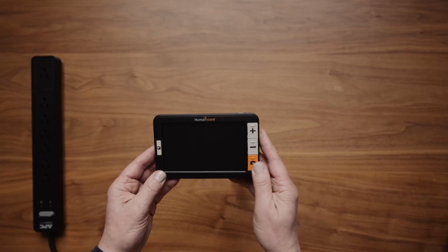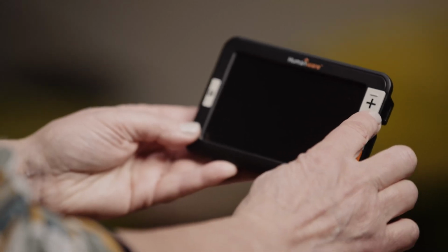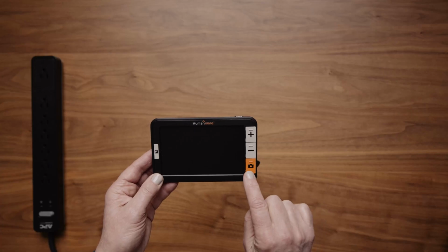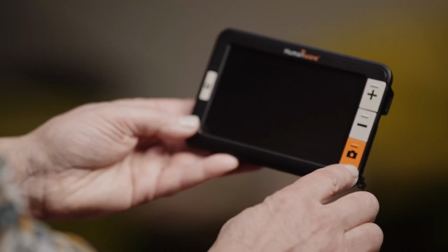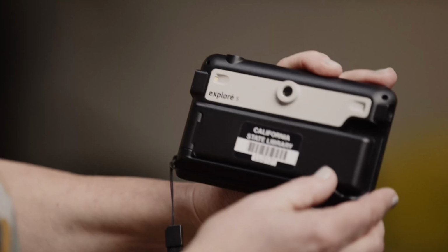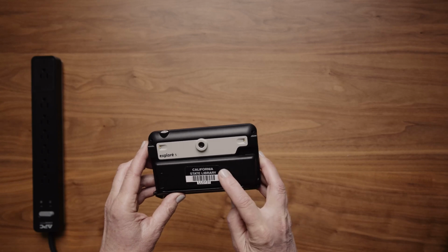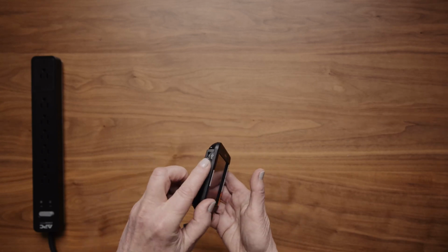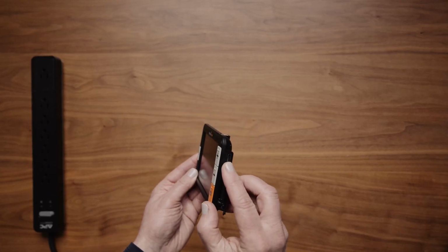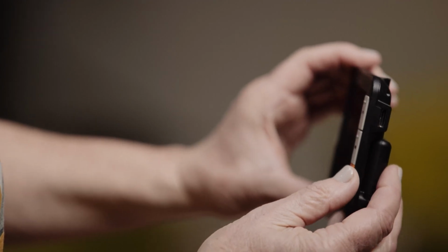The right-hand buttons on the front face are: top button, zoom in plus; middle button, zoom out minus; bottom button, freeze image, orange button. On the back of the Explore 5, you will find the camera, 2 LED lights, and handle. The top left side of the Explore 5 has the power port. The top right side has the high-resolution video output cable port.